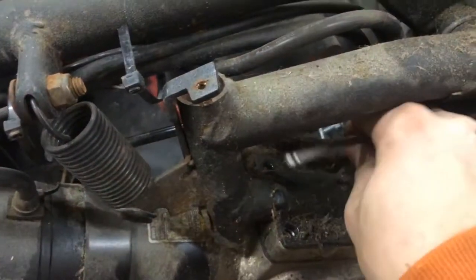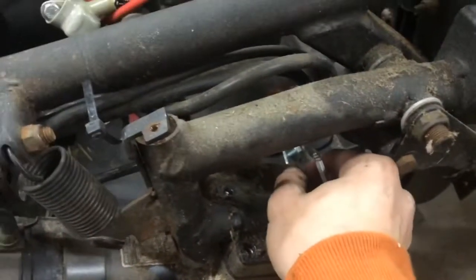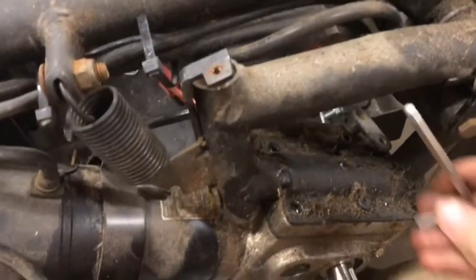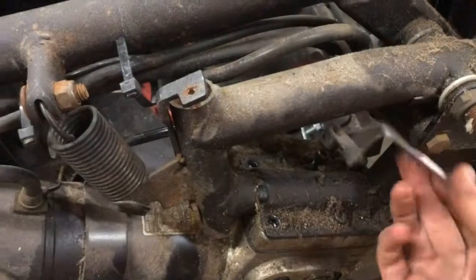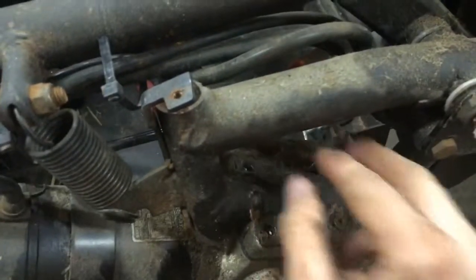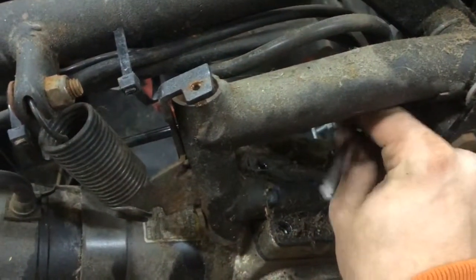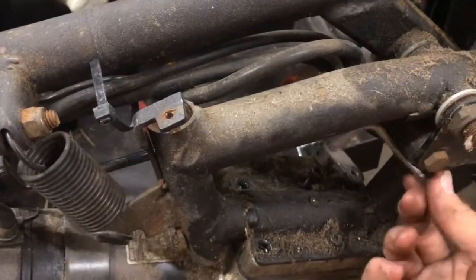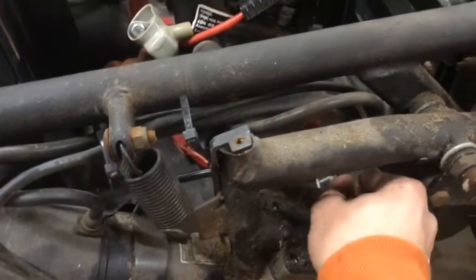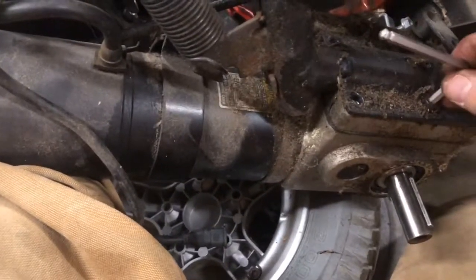Okay, we're actually almost done with this job. After we get these two Allen screws off, we will have to unplug it from the control box. So let's go ahead and take these out. There we go. Let's get these two.